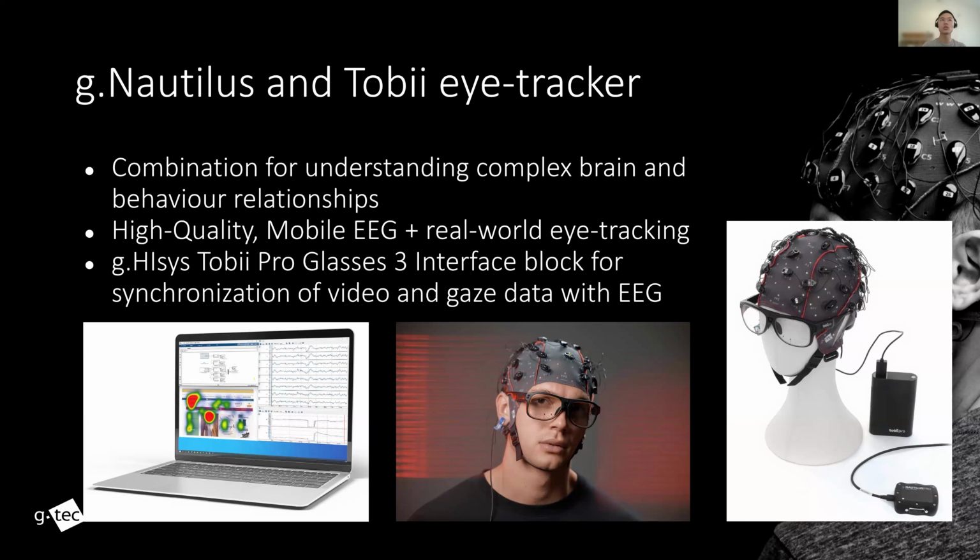Maybe another application is for training and safety. Sometimes companies use it for training their workers, making sure they're following the steps, the instruction, and their gazing matches with the control.